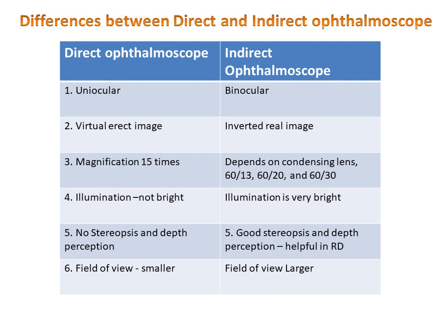The condensing lens normally used by almost all ophthalmologists is 20 diopters, but some doctors may also use 13 diopter and 30 diopter condensing lenses. So if a 13 diopter condensing lens is used, the magnification will be 60 divided by 13, approximately 5 times. The commonly used condensing lens is the 20 diopter lens. 60 divided by 20 will be 3 times the magnification.